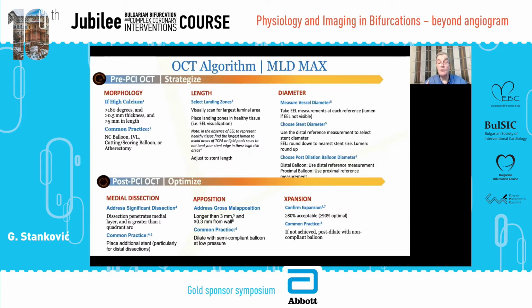So by using this software, we can really assess the presence of calcium from the beginning, quantitatively: more than 180 degrees, thicker than 0.5 millimeter, longer than 5 millimeters. So we will get a suggestion from the first pullback before the procedure on whether we need specific devices for lesion preparation and how to plan the strategy based on the findings.